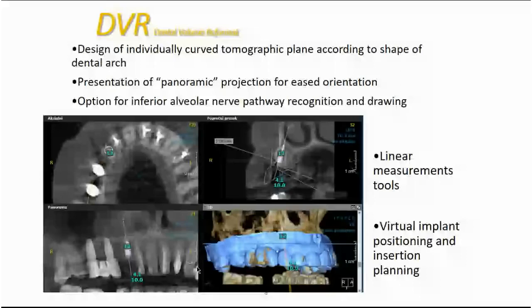During this year, I hope we will have a big change, because some additional tools will be economically available in the market here, and we will have intraoral scanners available more than previously. We will have implant guide software available for the production of guides in implant surgery, and I hope that during this year or the next we will be able to put our quality one step forward.